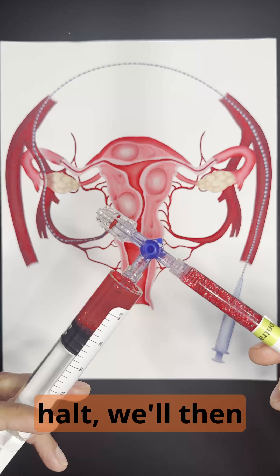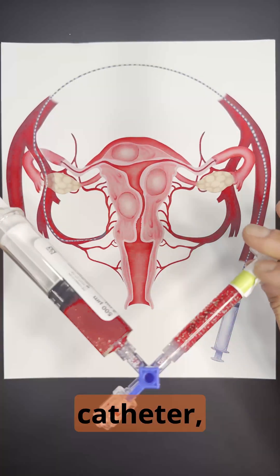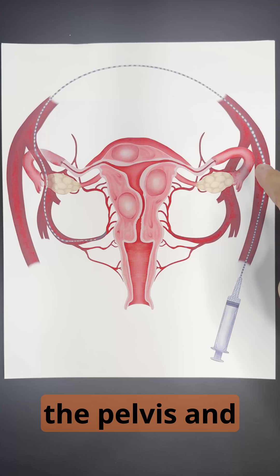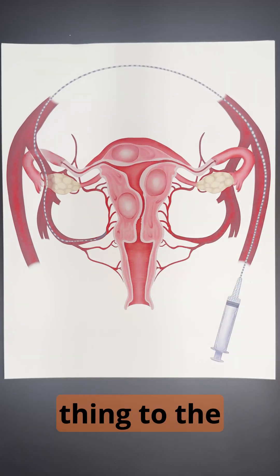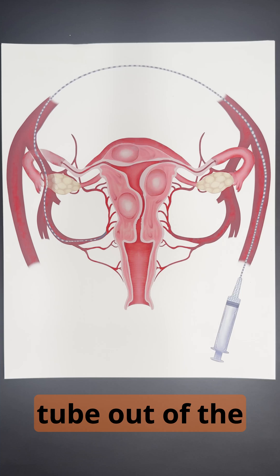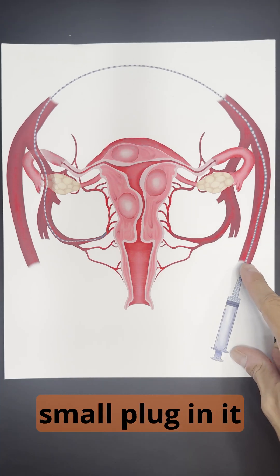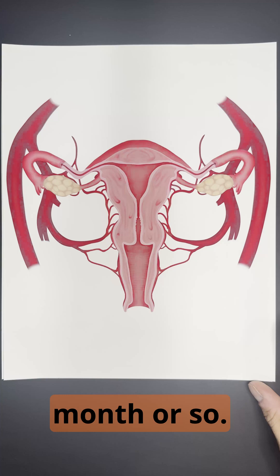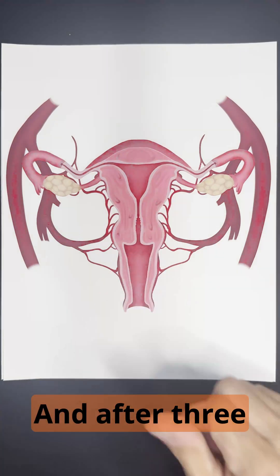Once the blood flow comes to a halt, we'll then take our catheter, reposition it into the other side of the pelvis, and then do the same thing to the other side of the uterus. Once we're all finished, we'll remove the tube out of the artery at the top of the leg and put a small plug in it, and this plug will dissolve over the next month or so.